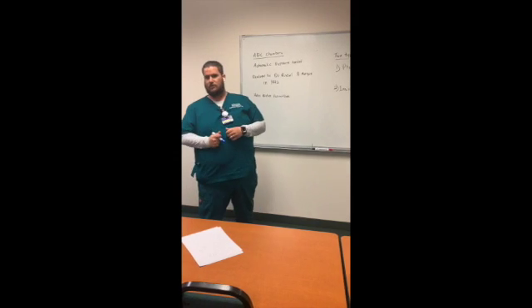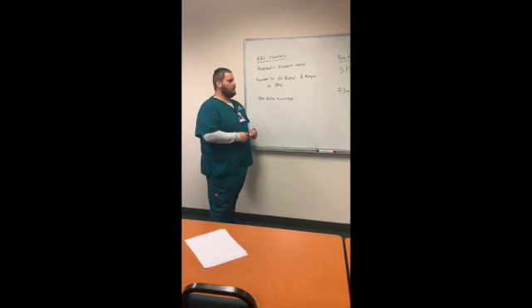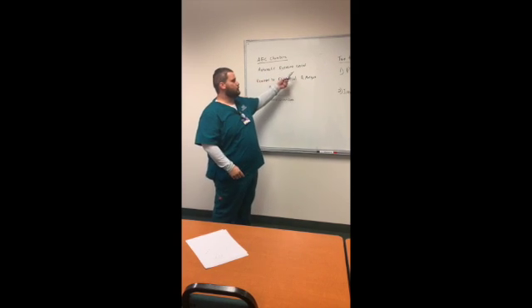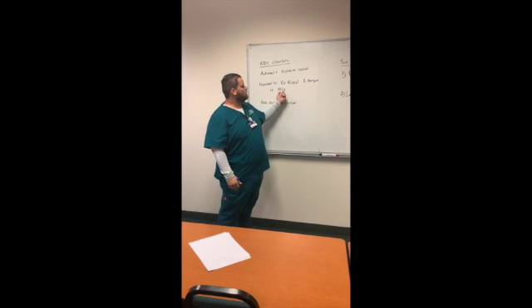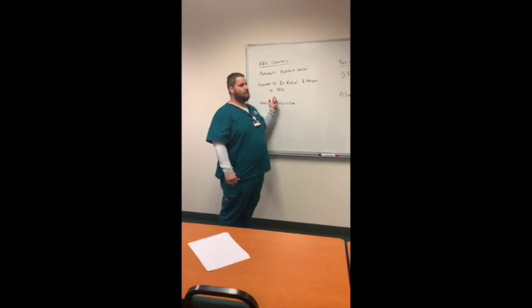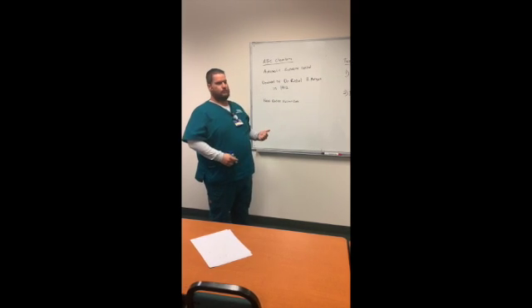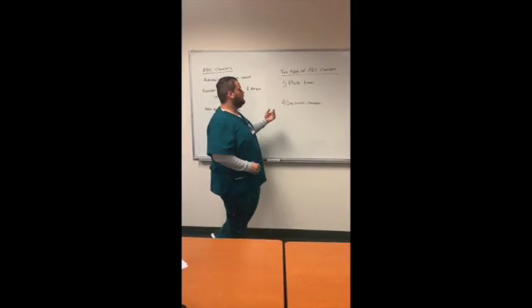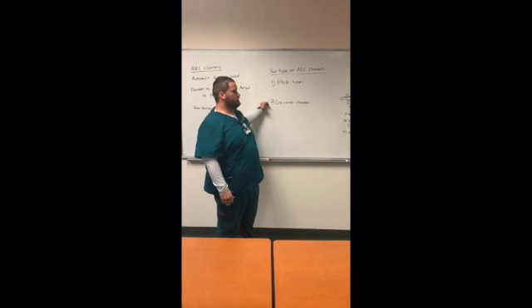My name is Joshua Blanco, and I'm here to tell you about AEC Chambers. AEC stands for Automatic Exposure Control. It was created by Dr. Russell Morgan in 1942 to help reduce patient exposure. There are two types: the phototimers and the ionization chambers.